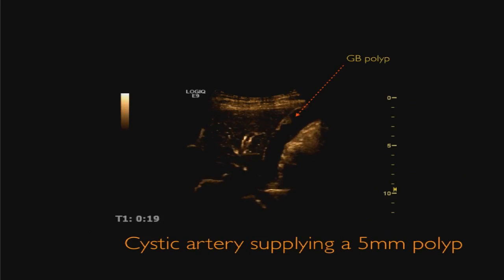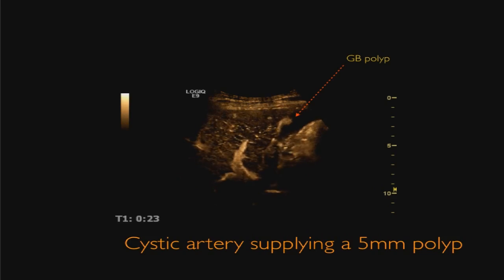Okay, so the cystic artery may supply these polyps. So this is a small polyp here, 5 millimeters in size, and you can see the cystic artery, and you can see the enhancement of this polyp quite nicely.